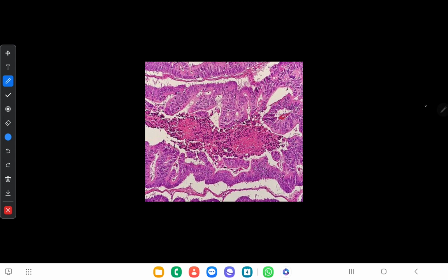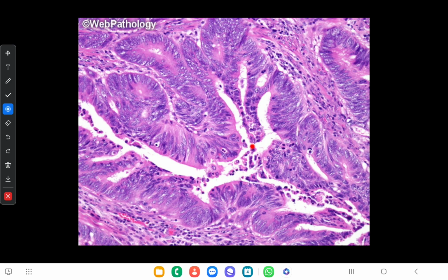Here you can see necrotic cells. Here there are some nuclear and cytological changes as well. You can see the cells are distorted, and hyperchromatic and pleomorphic nuclei are there. Hyperchromatic and pleomorphic nuclei can be seen, and also other cytoplasmic changes. Usually the cells are enlarged.